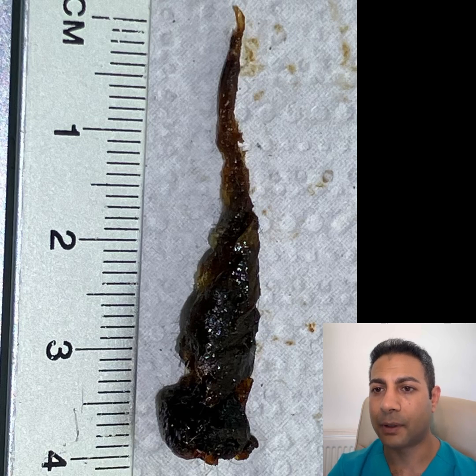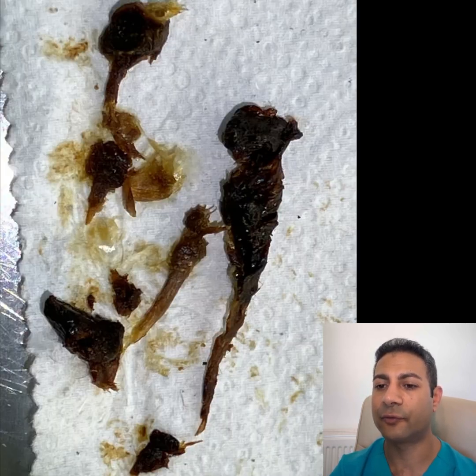And there's that big plug of wax and keratin tail, so it's measured in at 4 centimeters.